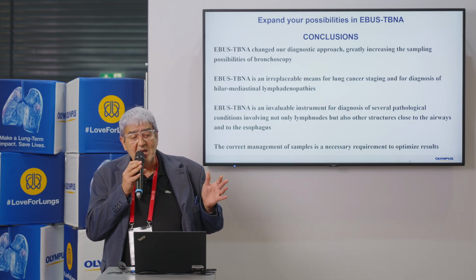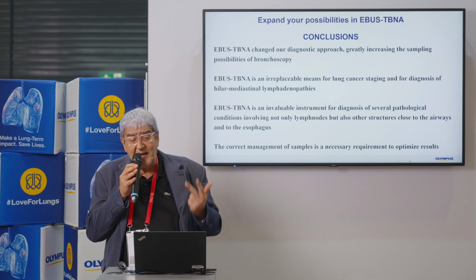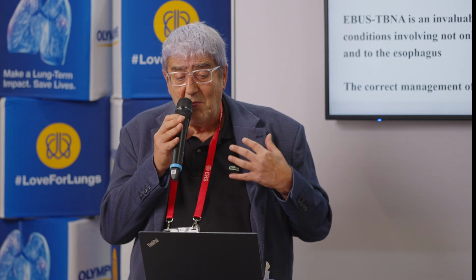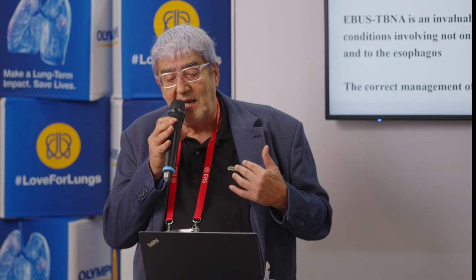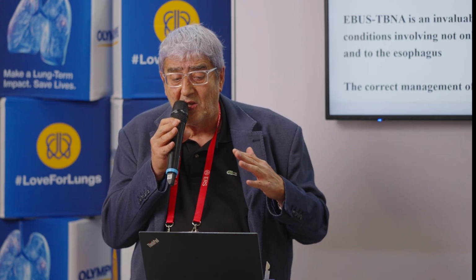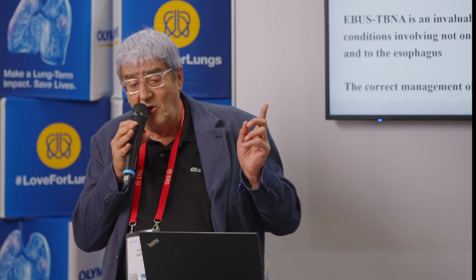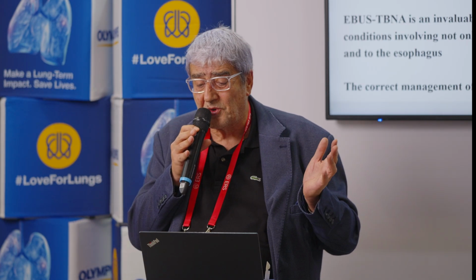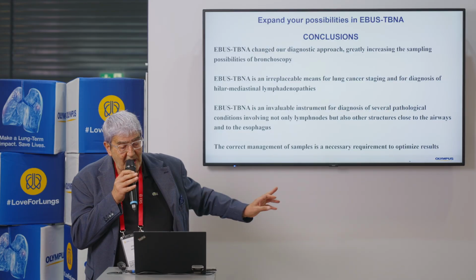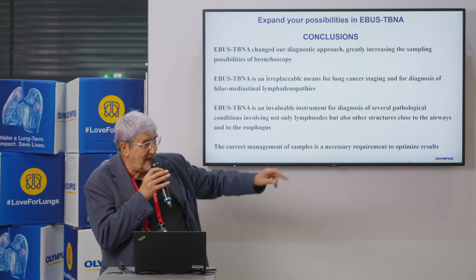It is today an irreplaceable means for lung cancer staging, for diagnosis of hilar and mediastinal lymphadenopathies, but it is also a very precious instrument for diagnosis of several pathological conditions involving not only lymph nodes, but also other structures close to the airways and to the esophagus. Correct management of samples is, of course, a necessary requirement to optimize results.